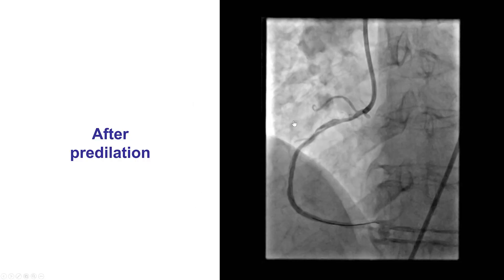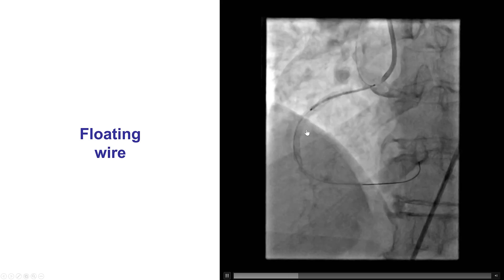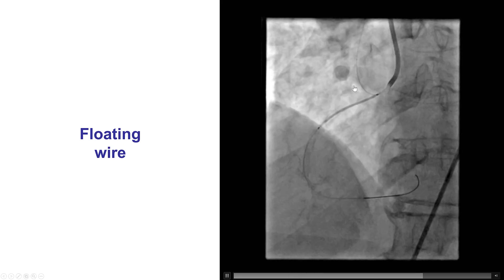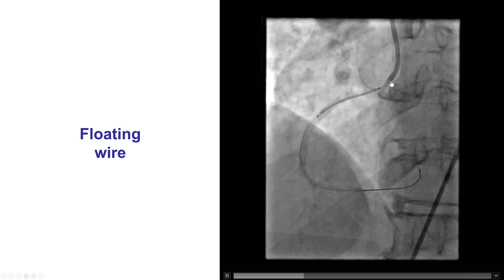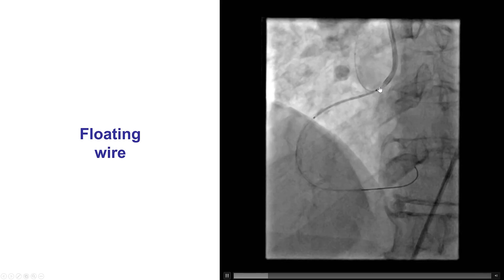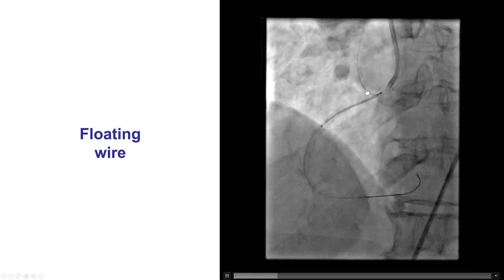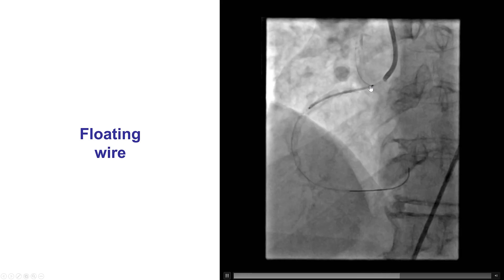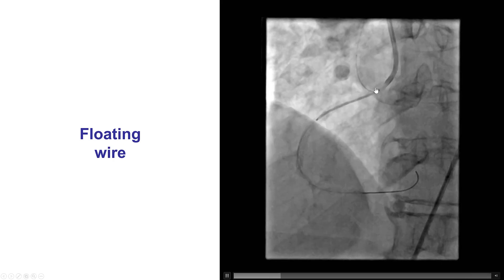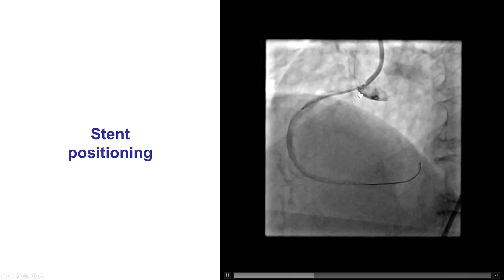Predilatation was done and that caused dissection, which can actually be a good thing because it's likely to cause expansion — but of course it is critical to prevent losing wire position at this point. After placing a stent in the mid-right coronary artery, it is now time to place the stent in the proximal segment all the way to the ostium. We placed another workhorse wire all the way in the aorta. This is the floating wire, and what this does is create a marker about where the ostium of the vessel is.